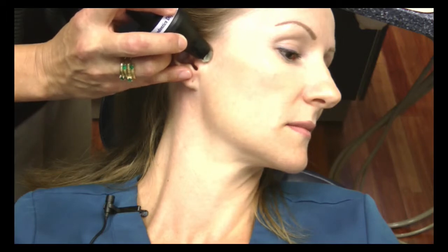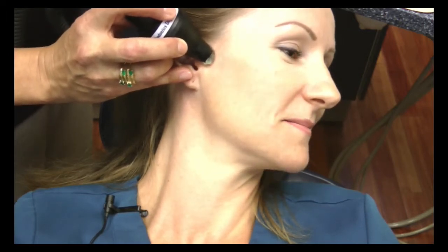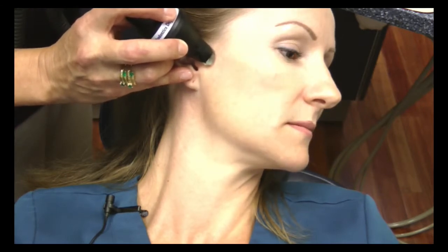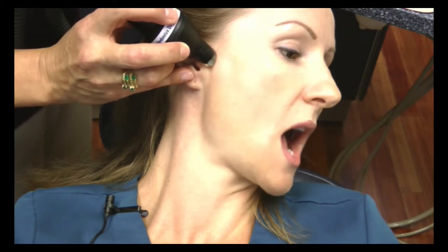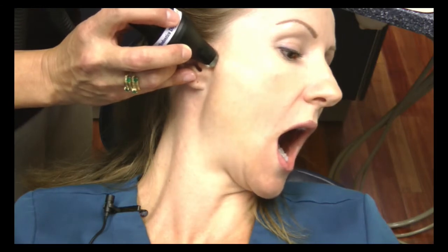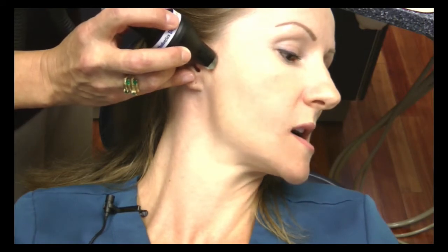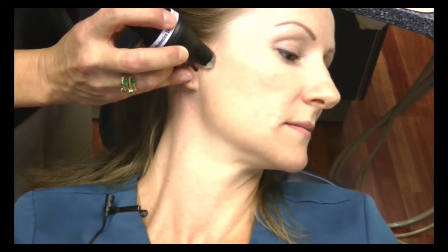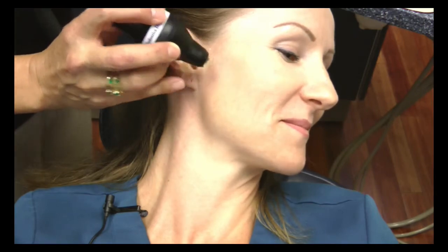Open and close three times fast. Perfect. Now open a quarter inch and close. And a quarter inch and close. And open as wide as you can and close. Move your bottom jaw toward me, and back, and away from me, and back. Toward me one more time, and back, and away from me, and back. Perfect. Thank you, Shelly.